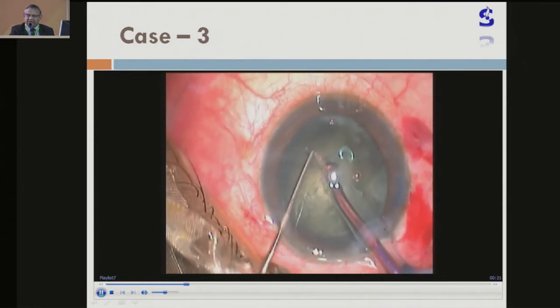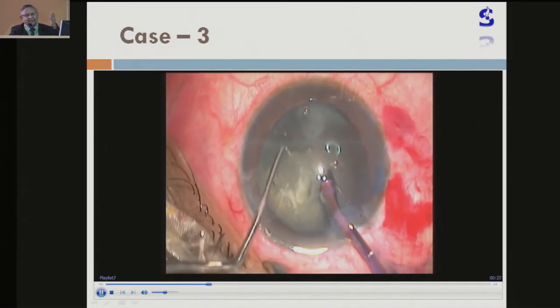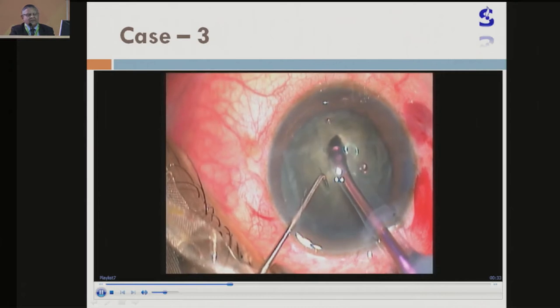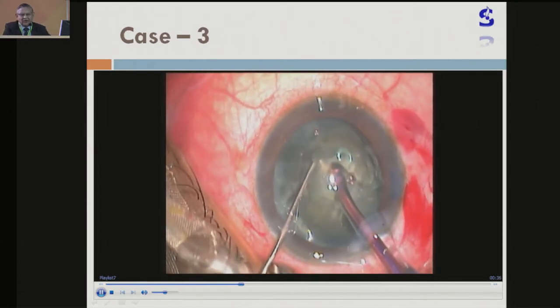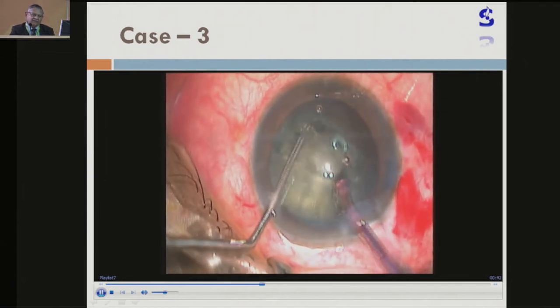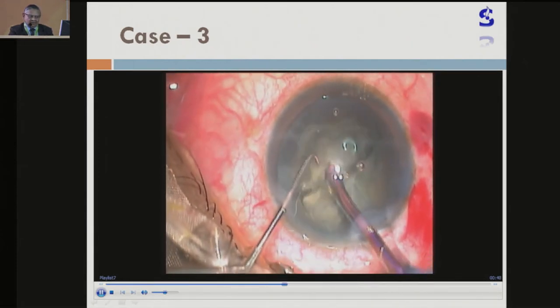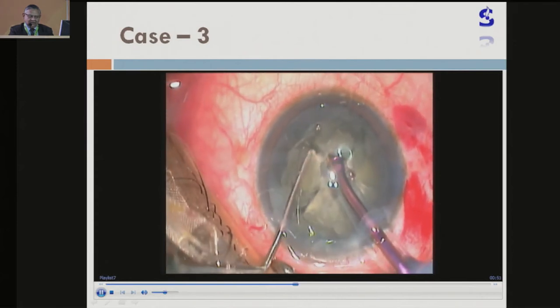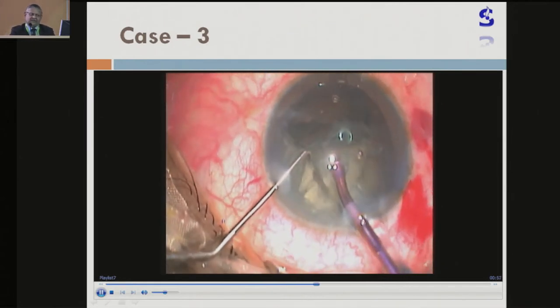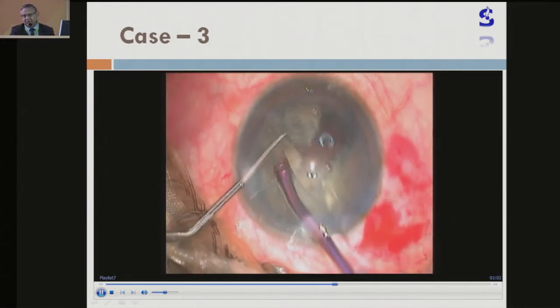Here the chopping, as I told you, may not be absolutely vertical or in a linear fashion — it may be a little irregular. So depending upon the size of the piece you can further divide into two or three. But see, it all goes down to the deeper layers. Once it is done, go deep to the center, and I tell you — even with this method, with this chopper, I go up to grade six, grade seven, direct chopping without any issues.